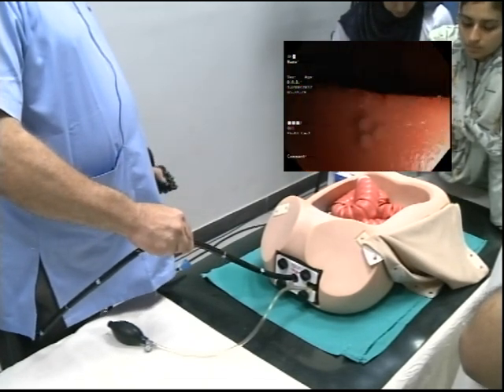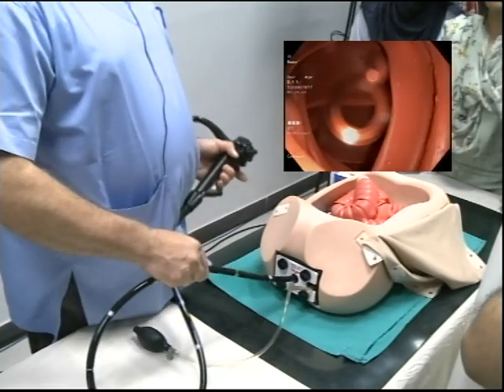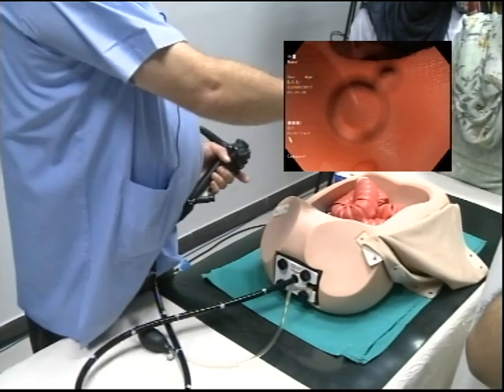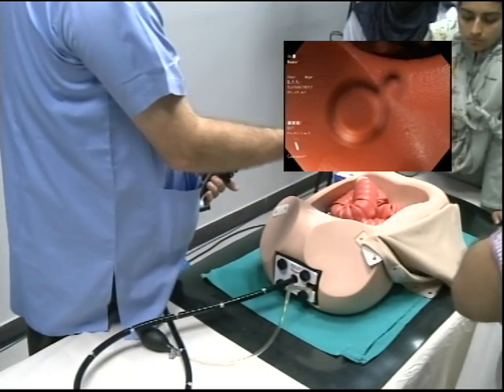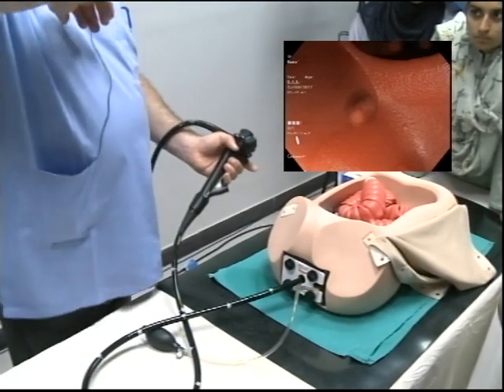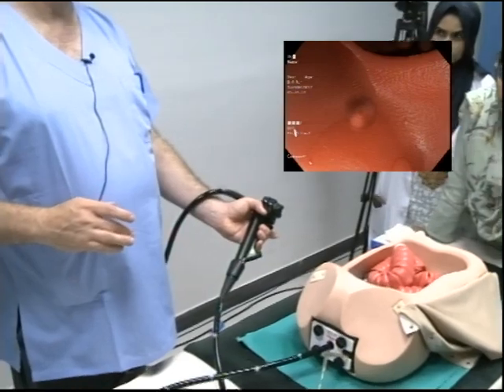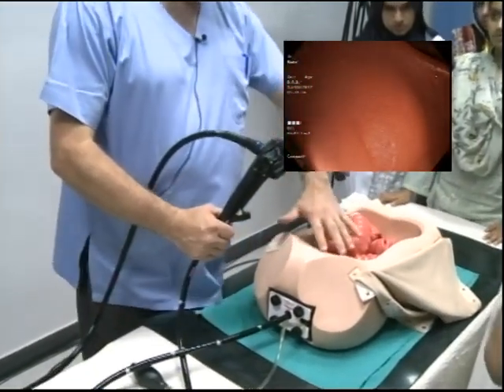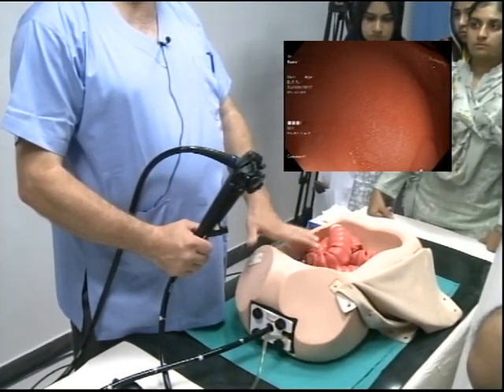Watching the screen won't show you what's happening in the abdomen. So you need to watch, see what it's done? So it pulls this down, and that's by coming anteriorly. If you go posteriorly, what happens is that the apex of the scope disappears underneath the spleen, causing lots of problems. If you get this bit right, this is a mannequin, but if you get this bit right, the rest of it follows. Not a problem.